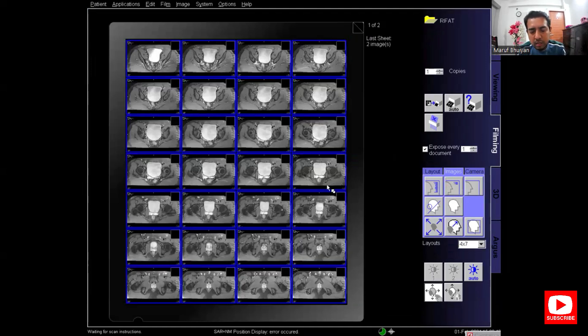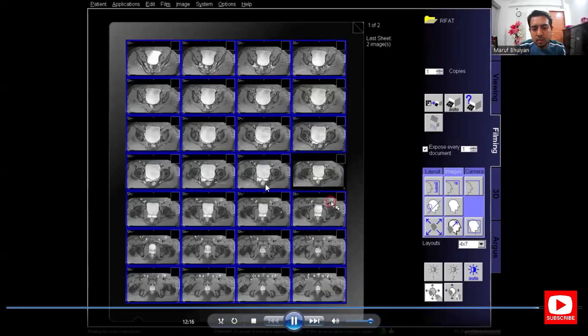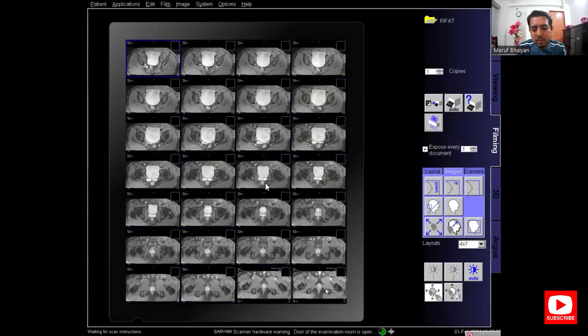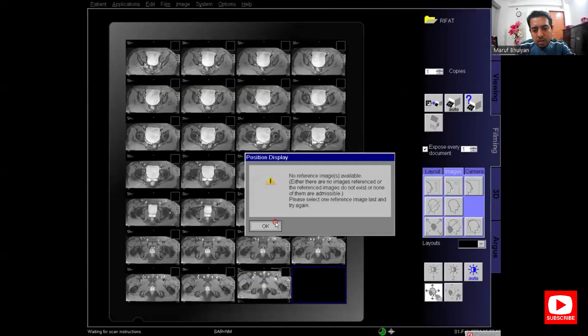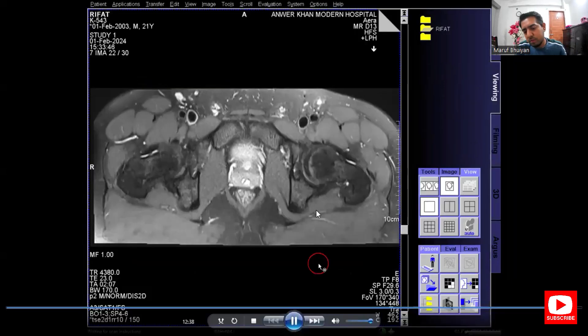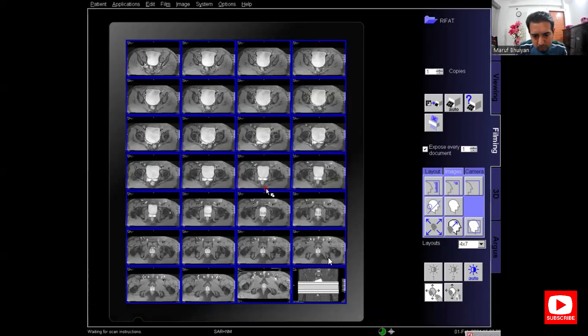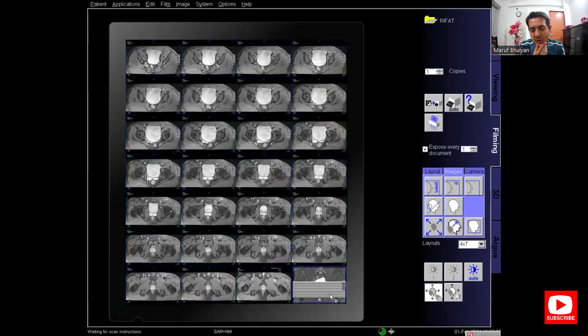On the same process, change the layout to 4x7. I am moving the patient out because the scan has finished. On filming, delete extra images so no extra film is printed. The last one is the reference image for the axial images — send the reference image to the film. Adjust the zoom, pan, and window before printing. This is the last film printed.